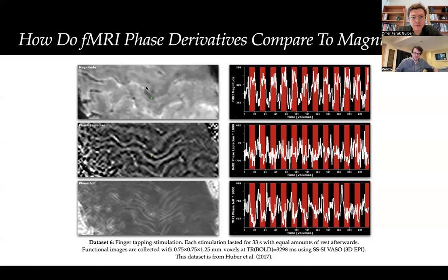This is one part of the gray matter. Gray matter here, I believe this is the motor cortex up here and some of the sensory cortex down there. And Renzo can correct me if I'm saying it incorrectly. It's all correct. I think it's a single run, very thick voxel. Oh, okay. This is a single run.